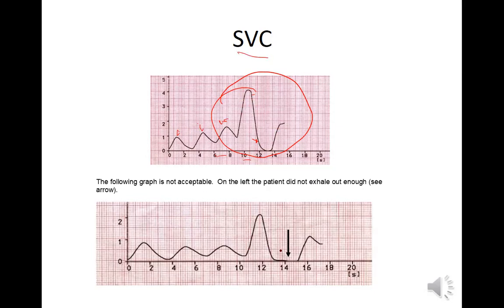This one's okay, but there's no pathology here, just that the student might have held their breath in expiration a little bit too long. So it didn't give you that nice bottom out, kind of flattened at the bottom. You should be able to recognize, and it's all in your book, that this is SVC. This is not minute volume. It's not the lung capacities. This is SVC. First breath is an inhalation.